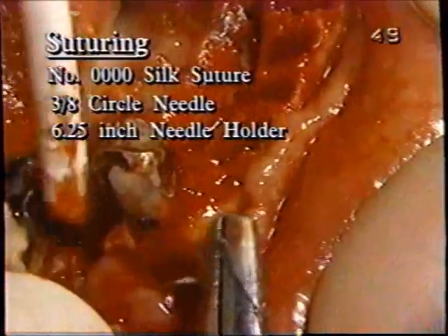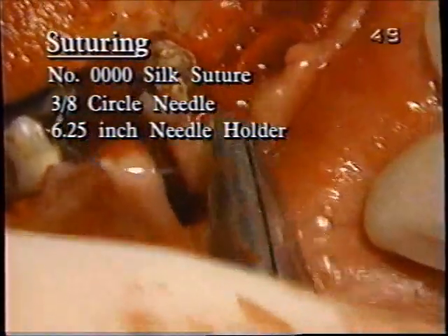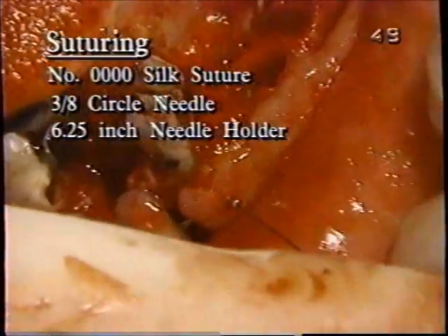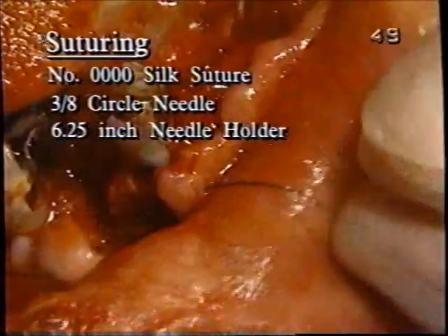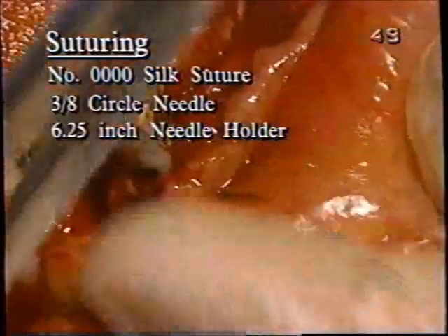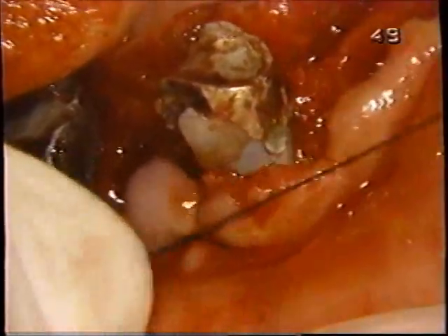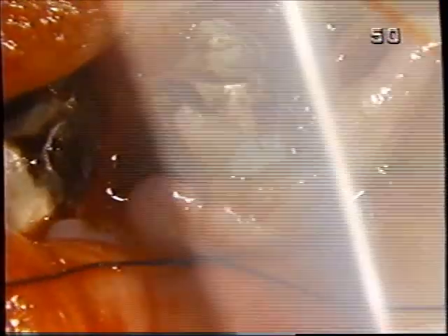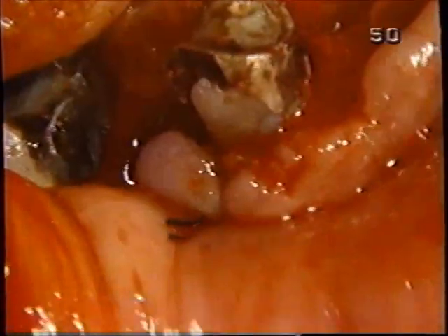I only use, I think, 3 different types of suture material. This is the workhorse type, and that is the 4/0 silk. More important than whether it's 3/0 or 4/0 is the size of the needle. The 3/8 circle is what is important, and not to have something like an X1, which is the huge half round.